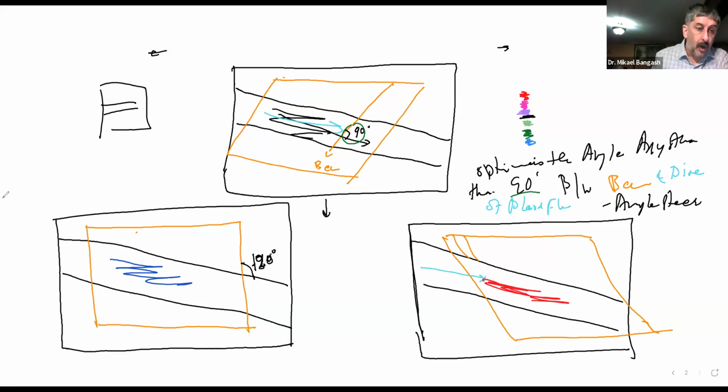So it's not always going to be that if your box is steered like this, it will necessarily make a 90-degree angle, because your blood vessel may run or slant across the screen like this.